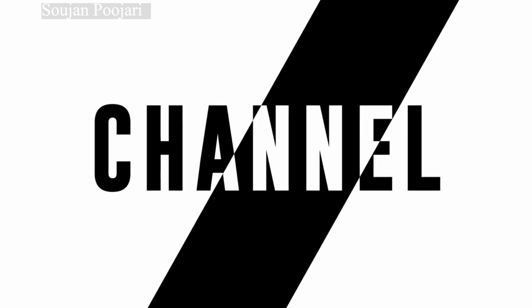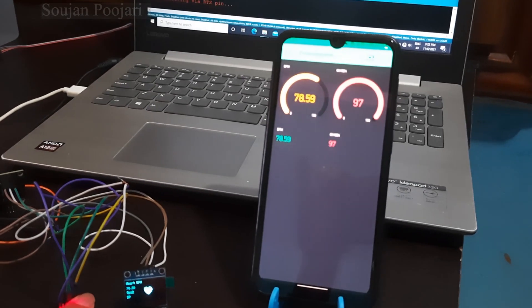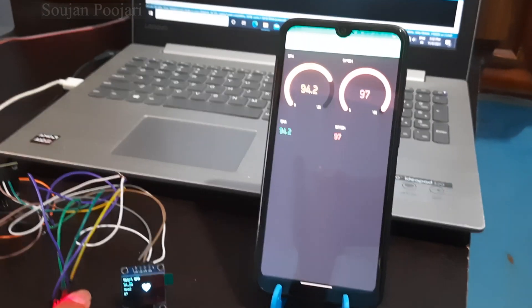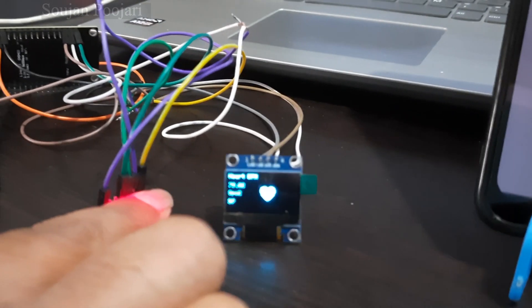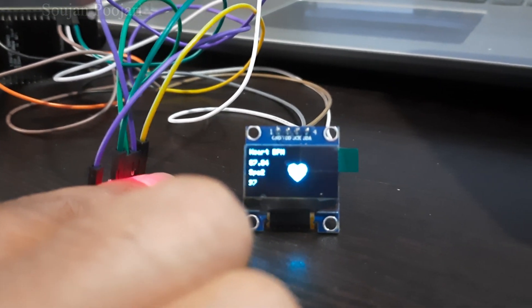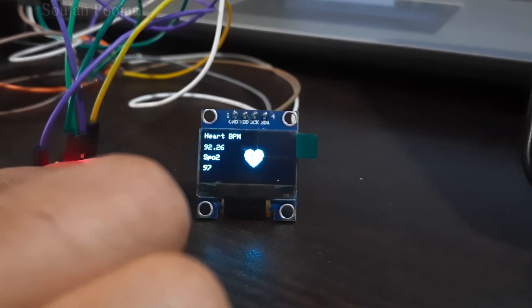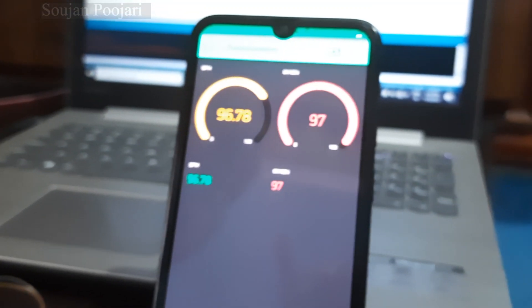Hello everyone, this is Sojan. Welcome to my YouTube channel. In today's video, we are going to see how to build a heartbeat monitoring sensor using NodeMCU and MAX30100 sensor. This heart rate monitoring sensor can monitor the heart rate and also the oxygen level of your body.